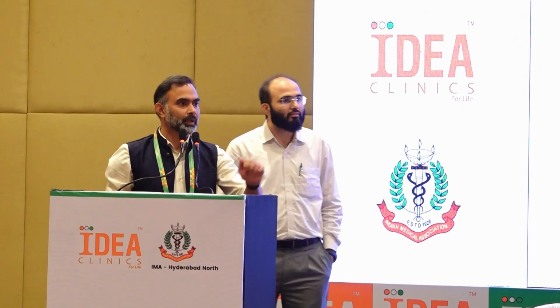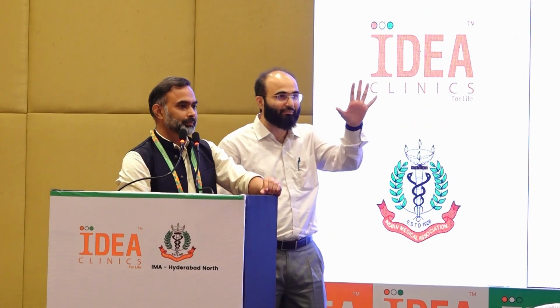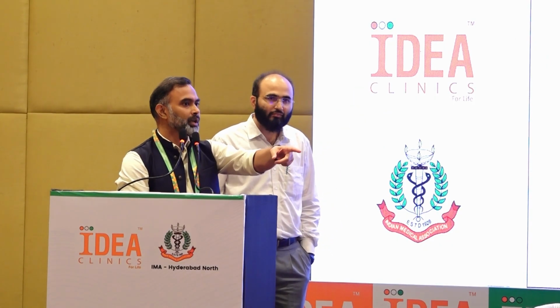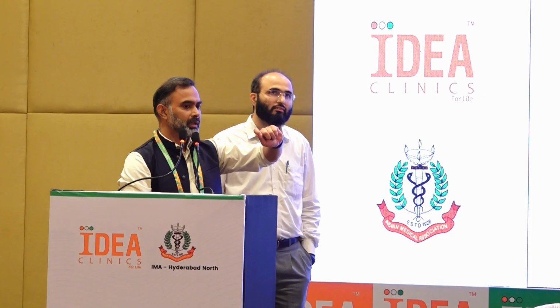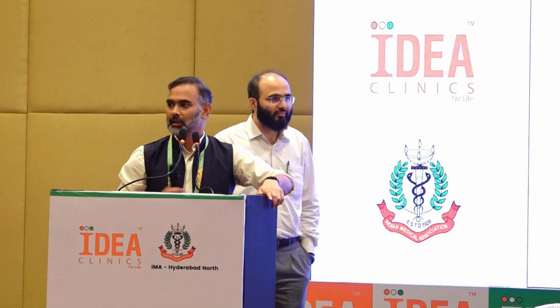Any malfunction is expected anytime? With the Medtronic, not yet. It is the only approved pump. You can expect some technical issues: the sensors may fail, yes, and the cannulas may get blocked. These are things that we see. Very small, which can be easily fixed.